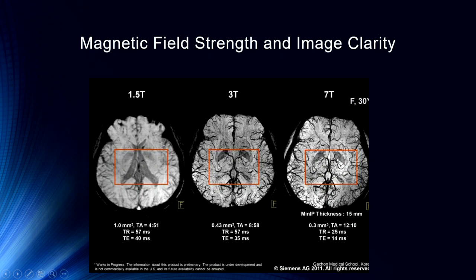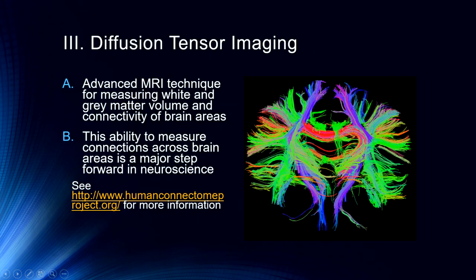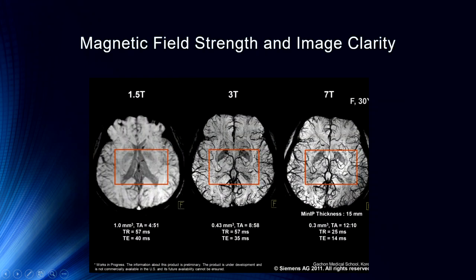So that's quite extraordinary. But you can see, you really get down to the blood vessels and everything as you get down further into these magnets. So that's where we can look at the structures, and you can see under here the corpus callosum, the ventricles, blood vessels. You can start to see over here in the 7T magnet, and then you can actually start to see some specific tracts of neurons as well.